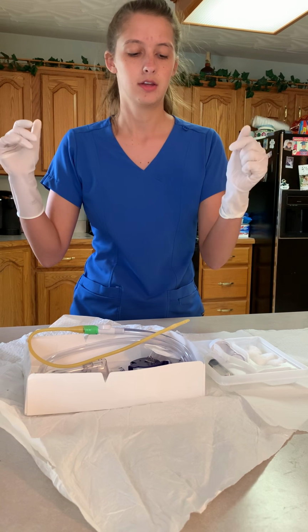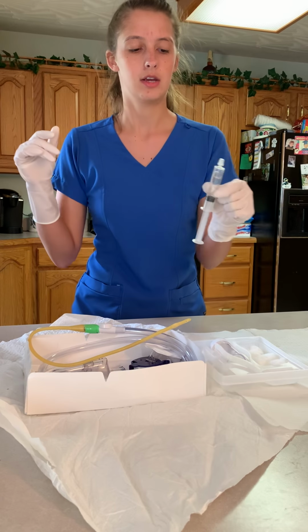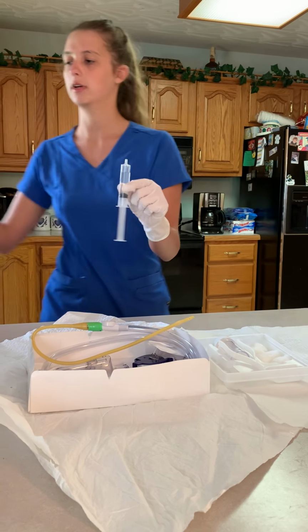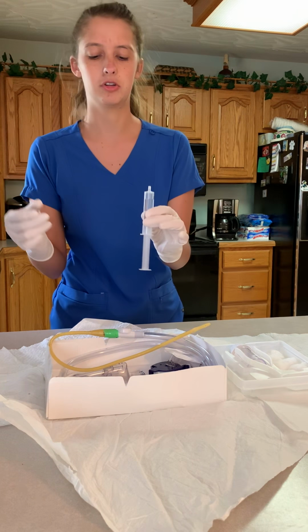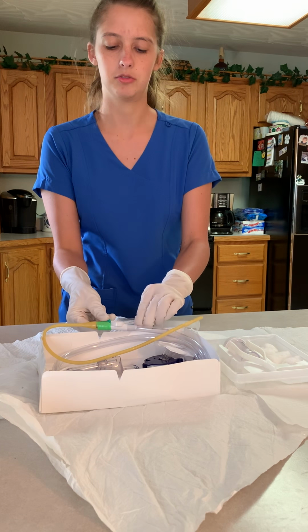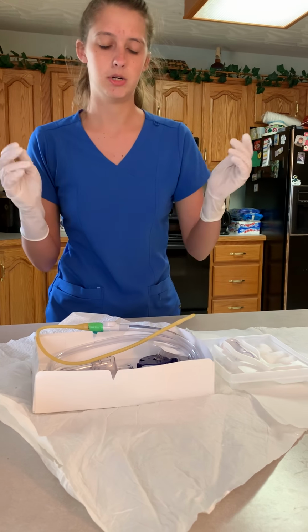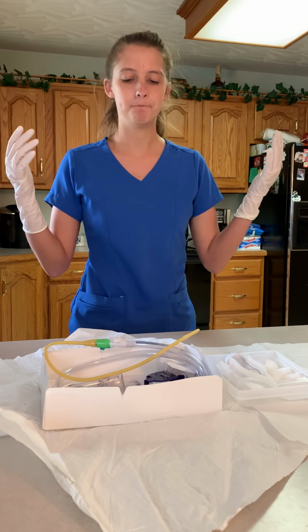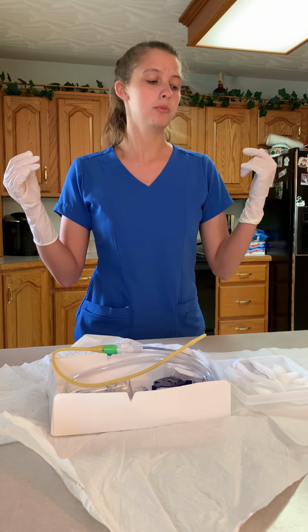Okay, and now I'm going to attach my syringe onto my catheter since I have 2 sterile hands. So I'm going to reach and grab my syringe, and we're going to remove the cap. We're going to go out and away. And now I'm just going to attach my syringe right there till I'm ready to use it. Okay, so now that I have my syringe ready, my catheter ready to go, we're going to first clean off the urethral meatus of the penis with our betadine cotton balls.